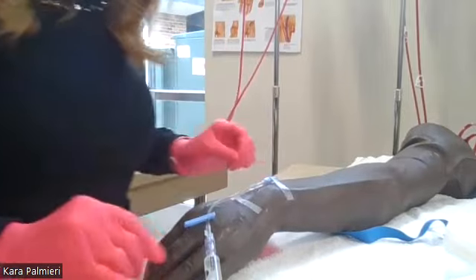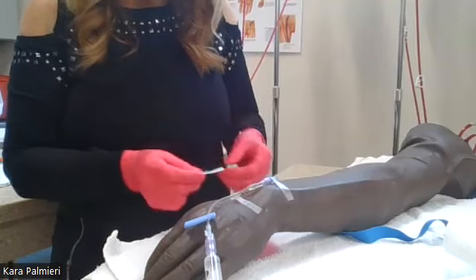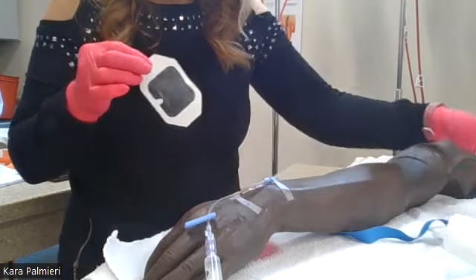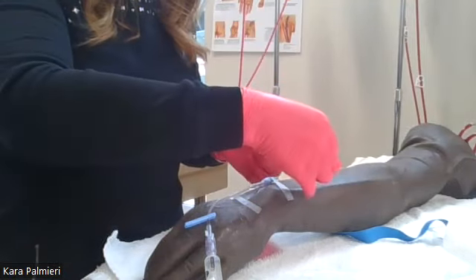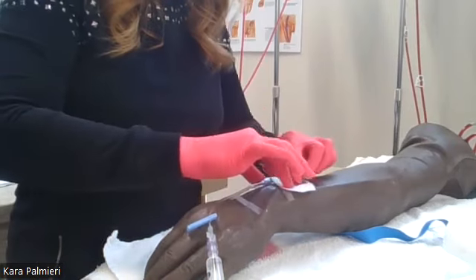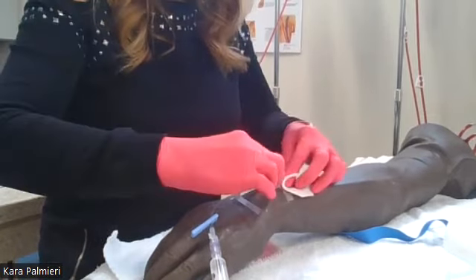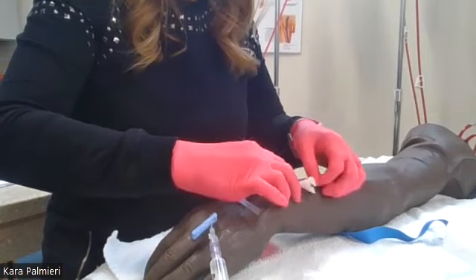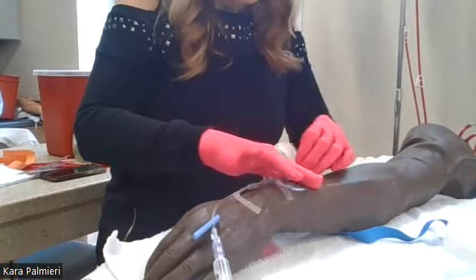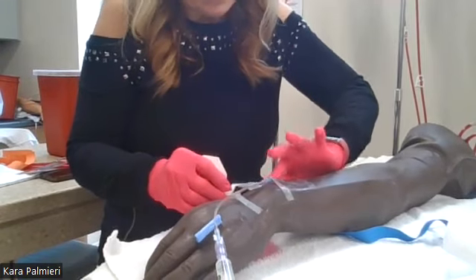Now I have this anchored enough that I'm ready to put my Tegaderm on. So I'm going to take this. And actually, if I wanted to, I could take my gloves off now. I'm going to take the backing off. And I want this Tegaderm to go up to the blue hub. Okay. So I'm going to start it in the middle and then work my way out to the edges, just like I did with the central line. And I like it nice and neat. I'm kind of a picky person about my IVs, but they last when I get them in.